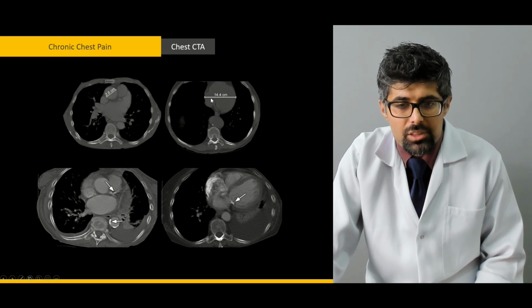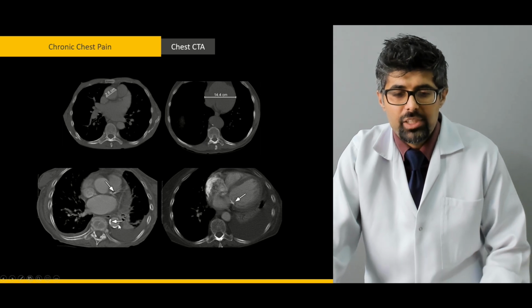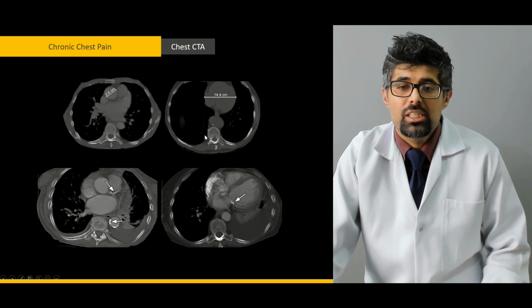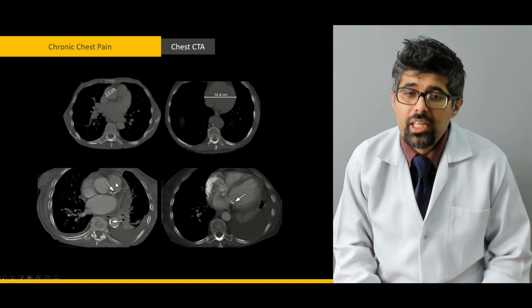The aneurysm here on all four of these confirms that this patient is suffering from chronic chest pain.